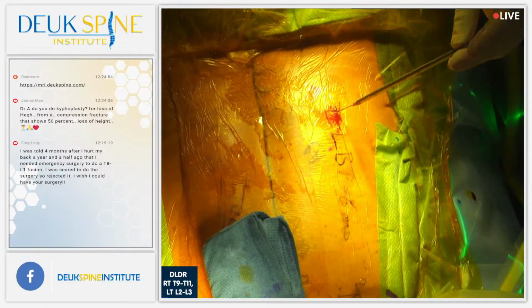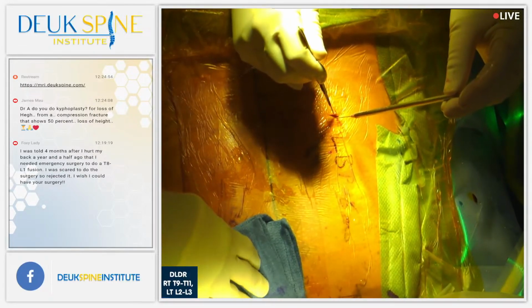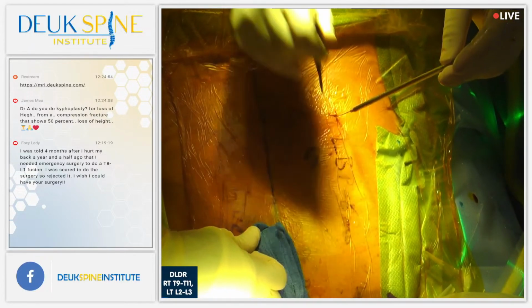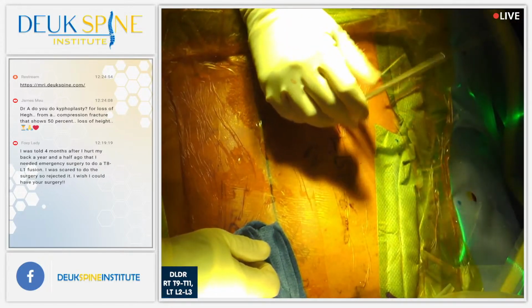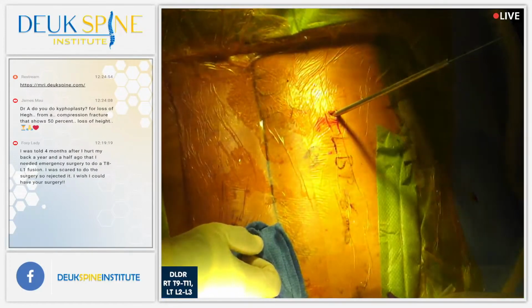Yeah, skin knife. So the way I cut, I left a little bit of tissue deep along the shaft of the guide wire. There we go. Numbing. Shot. Nice. So we're going to put a little more numbing medicine.